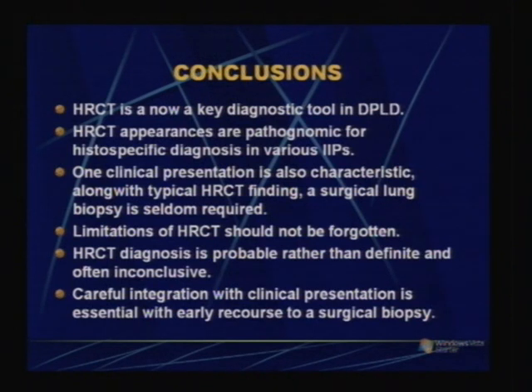and wherever you feel that HRCT is not able to provide the right diagnosis, it is important for us to consider these cases for biopsy, and in these conditions HRCT helps us to locate the proper site of biopsy for final histopathological diagnosis.